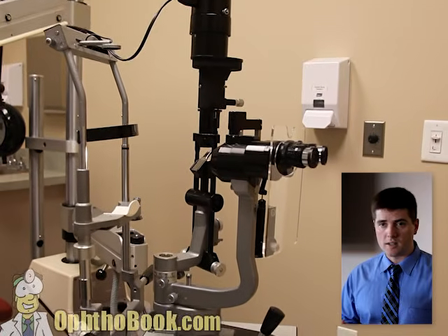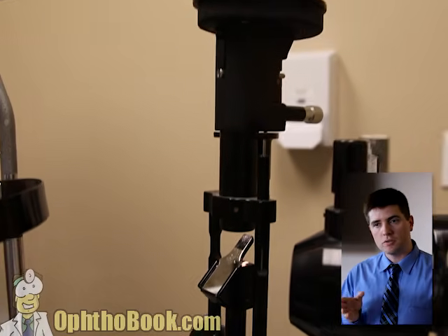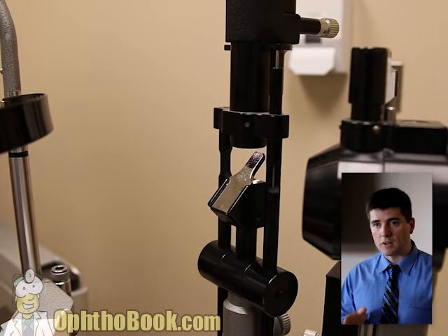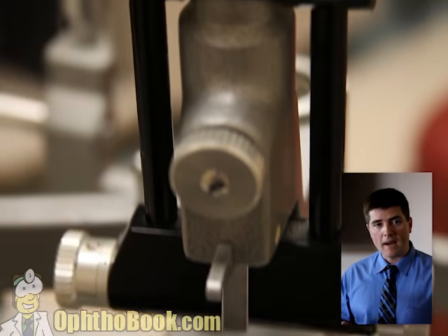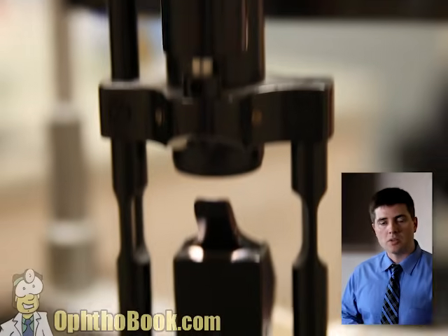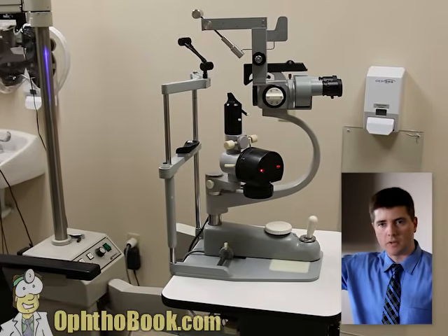This is the Haag-Streit that I learned on, and you may have in your own clinic. The light is above, shoots down through various filters and lenses, and strikes a mirror before hitting the surface of the eye. The only problem I have with this particular model is that the light column is so large and the controls are so spread out that it's a lot of work. You're constantly reaching above your head to use it.